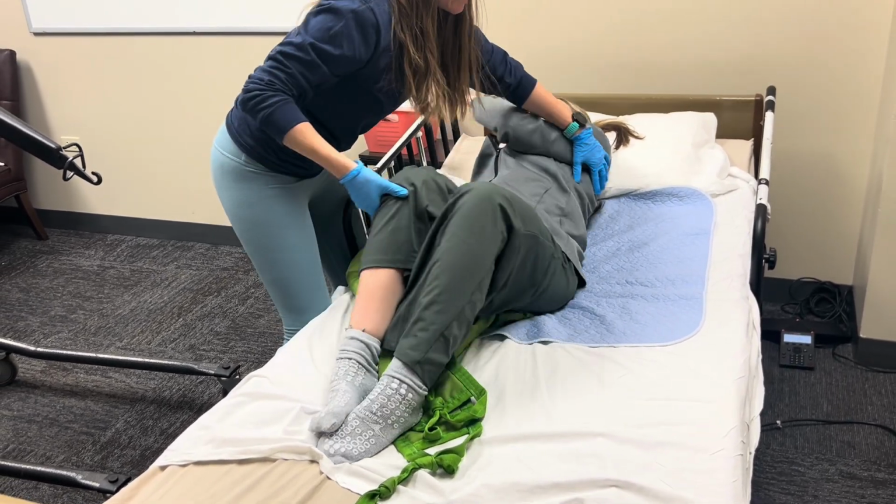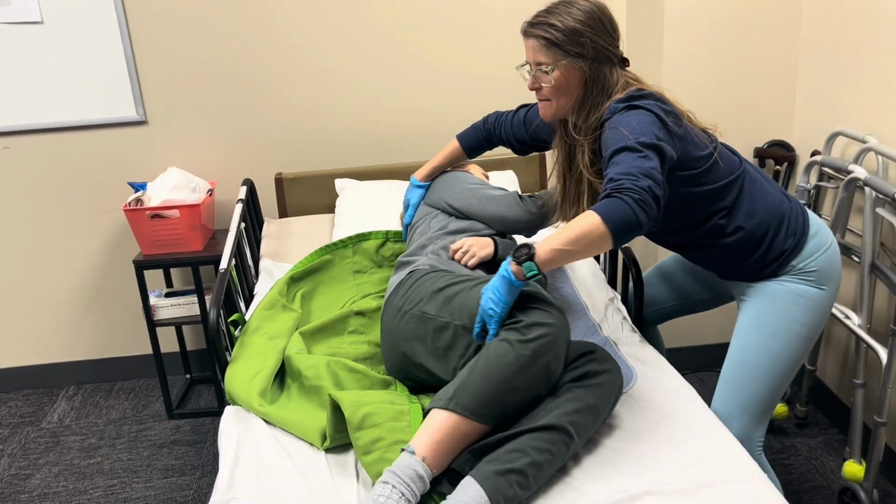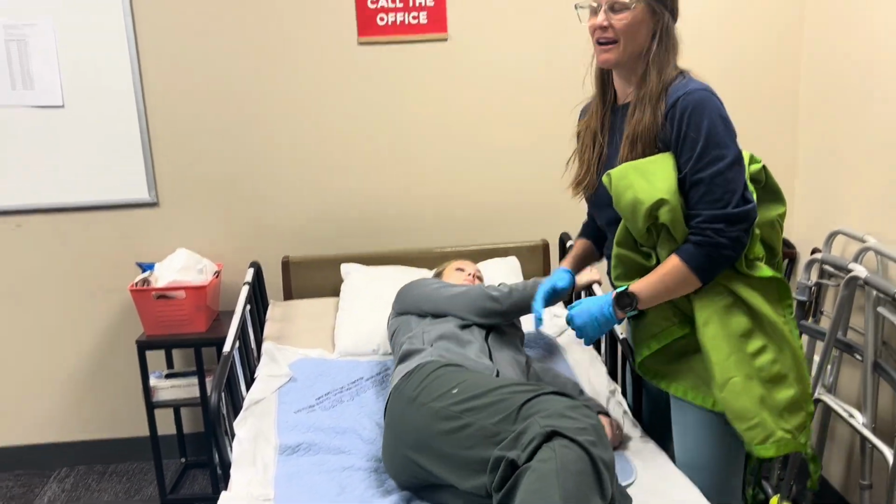Michaela, let's roll onto our back. I'm going to come to the other side. We're going to roll towards me. Perfect. Voila. Slings out. And then this is when I would get my client nice and comfortable.